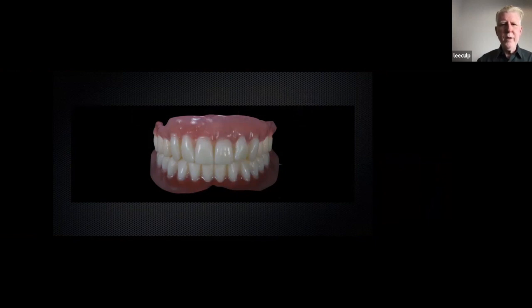But immediates, I do go to final milled, because one of the other things that is a slight challenge with the printed denture is getting a reline of PMMA attached to the printed resin. You've got to go through the same process. You've got to sandblast the inside a little bit, add a bonding agent that will allow your new PMMA reline to stick to the printed material. So it's just much easier on a milled immediate denture to go straight to milled. It's PMMA. We know you're going to reline it in the future, so we just go straight to mill.